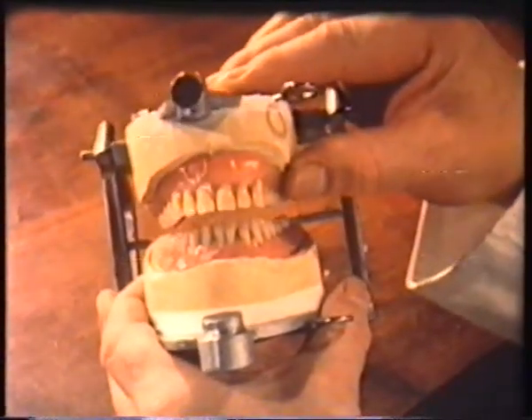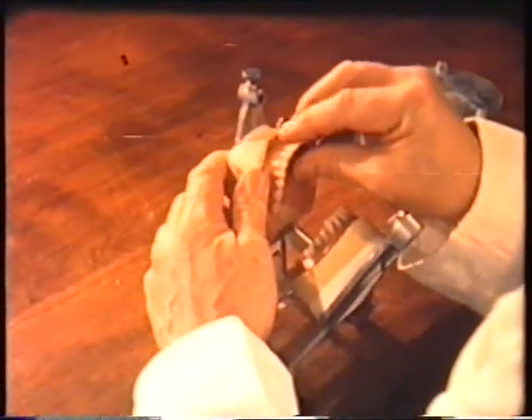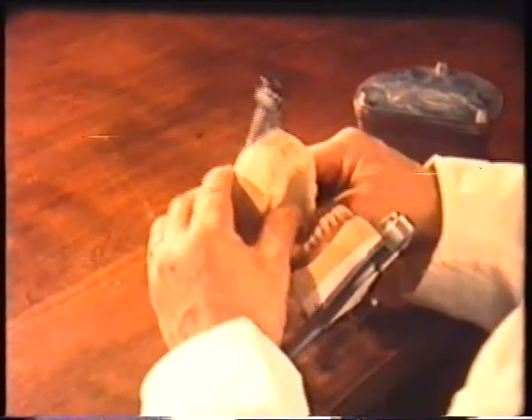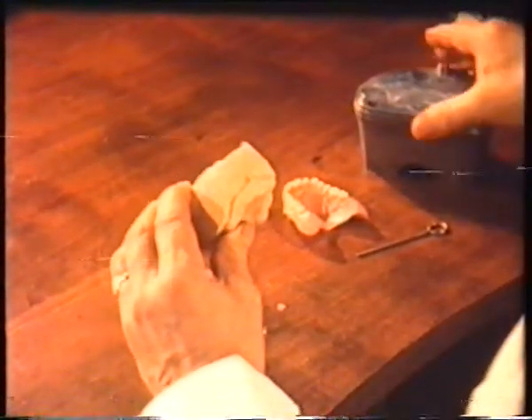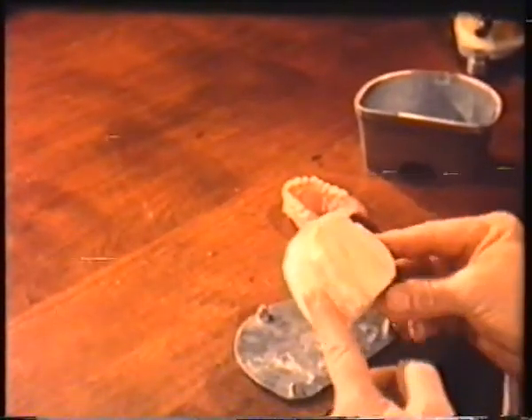When the setting of all the anterior teeth has been completed, the denture should be processed in acrylic resin. However, before this is done, it is necessary to make clear acrylic resin templates to both upper and lower models. These are necessary to indicate, during the surgical procedures, the shape to which the models have been trimmed, so that the removal of bone will be approximately the same.